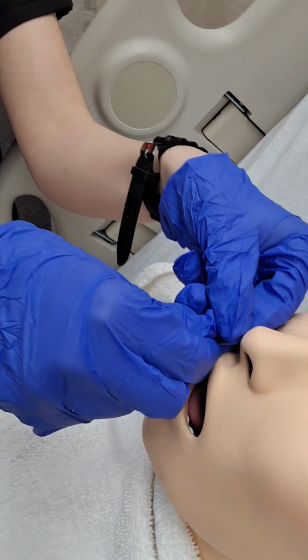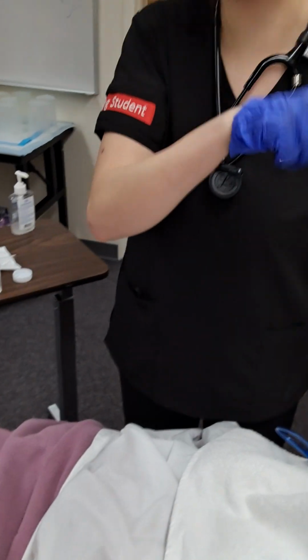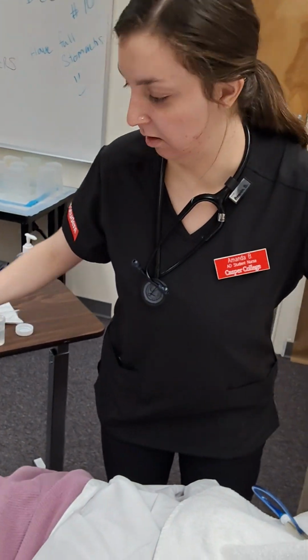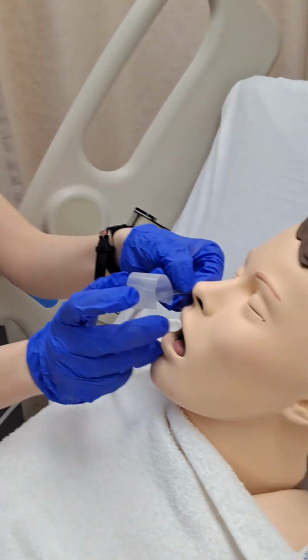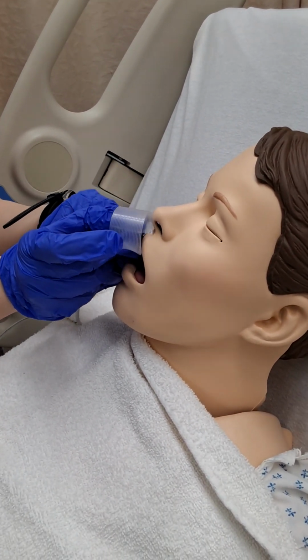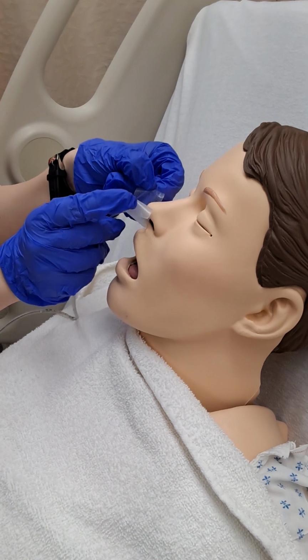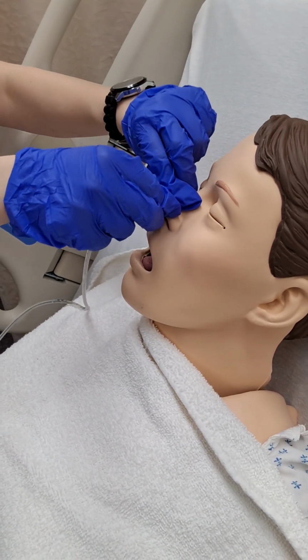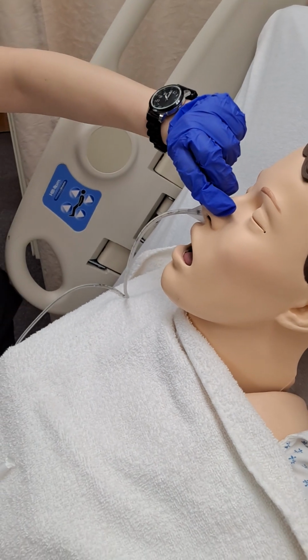So now I'm going to apply my skin barrier, but we don't have that, so we'll be just using some tape here. There we go. Is that painful? No? Okay.